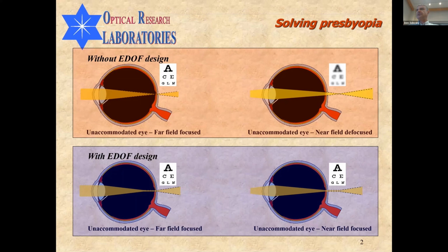There are several solutions. With spectacles, you have what are called progressive lenses, which are lenses having many focal lengths. And then the user chooses the right line of sight to look through the right focal length to see the object that he tries to see in focus. In contact lenses, and also in intraocular lenses, you have bifocal lenses, which allow you to see well remote objects and near objects, but you do not see well anything which is in between. For instance, you want to watch television, to work in front of a computer, or a woman wants to put on makeup, then they will not be able to see a focused image. So the solutions are only partial.